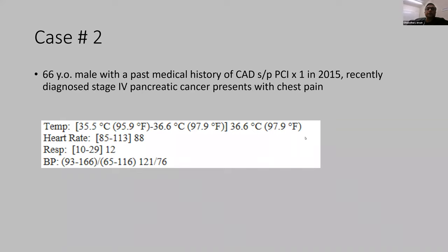So this is a 66-year-old with stage 4 pancreatic cancer. And this is actually a very important issue to me, that every time we see ECG, I think the way we are grown up, like in our medical school everywhere, we read ECG like a tracing. ECG is not a tracing. ECG has to be read in the context of clinical presentation. And I'll tell you how we learn from this case. Clinical context, clinical context, clinical context. And it's very important, because ECG means that we'll be doing a series of actions, and the actions have implications. So this patient had this EKG with chest pain.